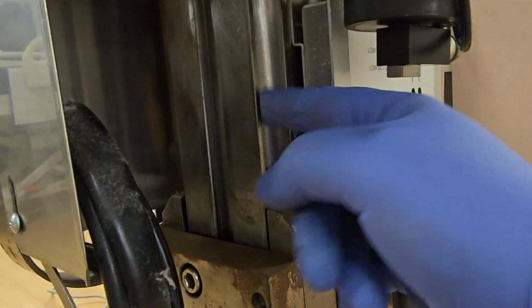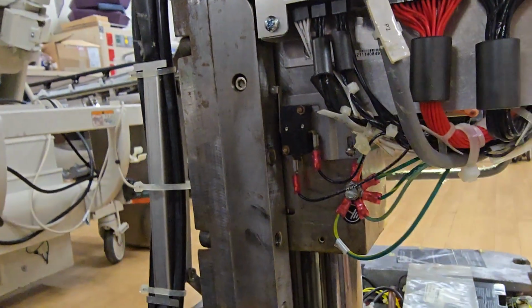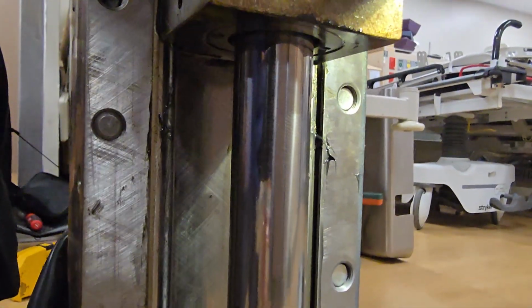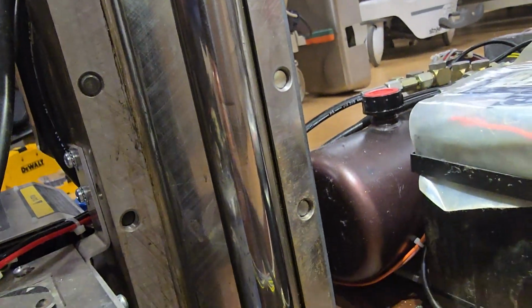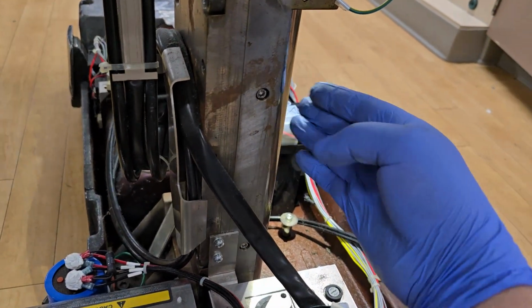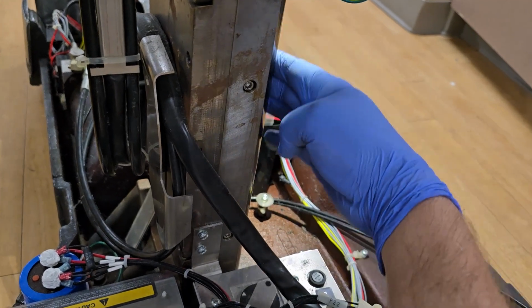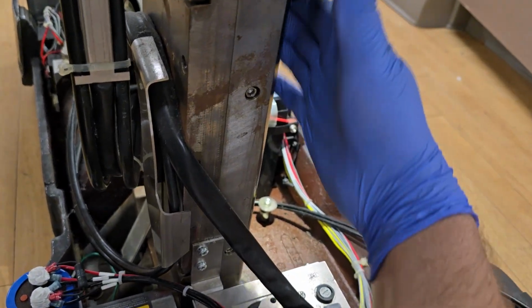So up here, first thing that I notice is that the linear rail is dry. It's very dry. You can see the underside right here. There are two rails and they ride on this block up here. So those two rails, they should be lubed. You can see we now have a fresh coat of moly lube on there. That way, it's for high tension. You can rub with a rubber glove down the rail, and if your hand sticks or you feel your glove being pulled, then there's not enough grease on there.